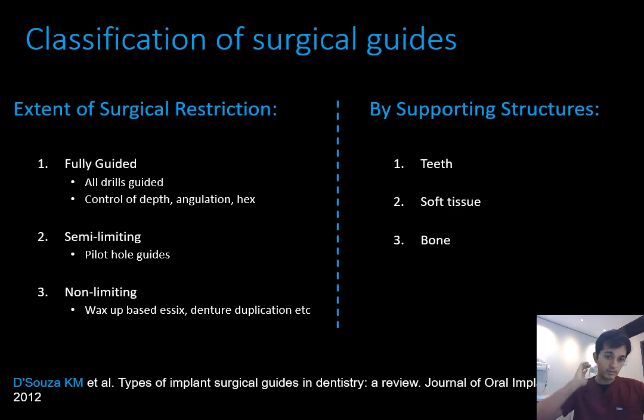Now, the third case is non-limiting, or the conventional approach, where you have a preoperative wax-up, you'd make an Essex or a suck-down over that, create a little hole yourself showing the center of the occlusal aspect, but that type of guide does not limit any deviation in your drill. So it requires a lot of operator experience and a lot of attention to detail to get it done accurately. As much as possible, I try and do all my cases fully guided and only settle for option number 2 or option number 3 if a fully guided case is not possible.